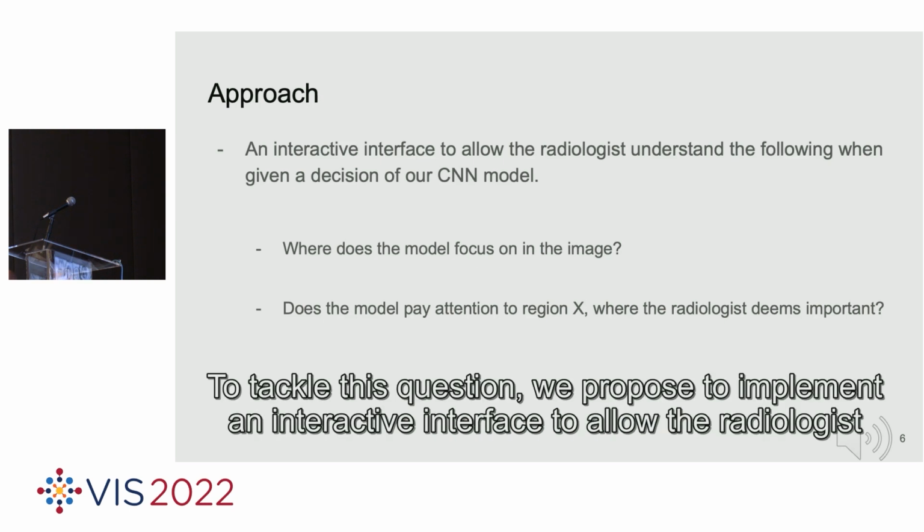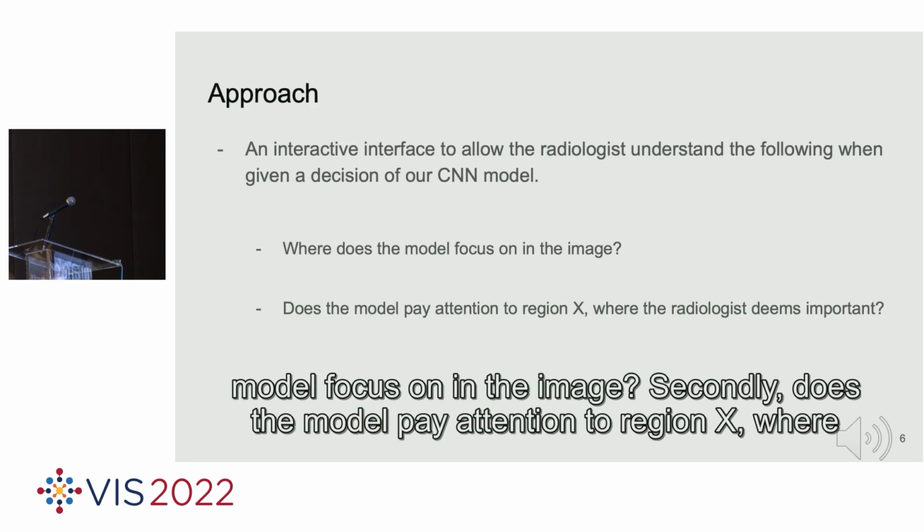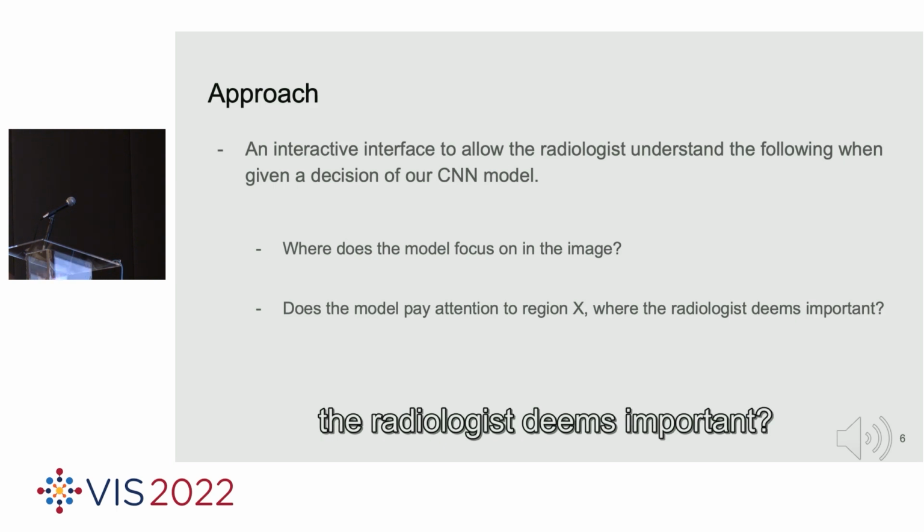To tackle this question, we propose to implement an interactive interface to allow the radiologist to understand the following when given a decision of our model. Firstly, where does the model focus in this image? And secondly, does the model pay attention to region X, which the radiologist deems important?